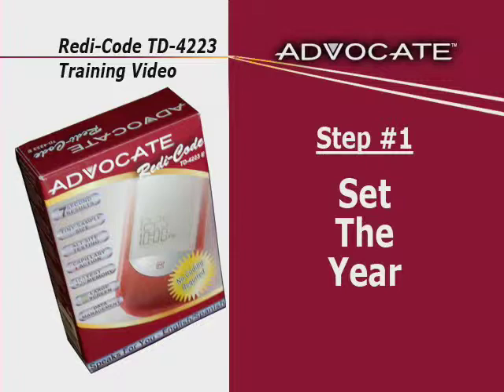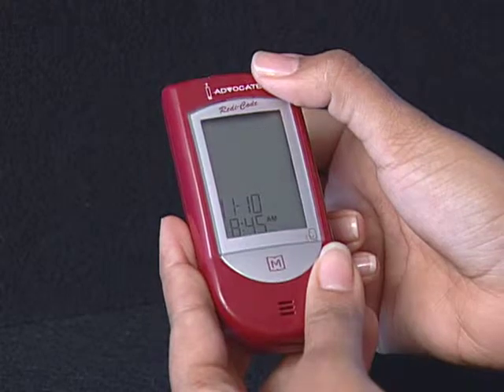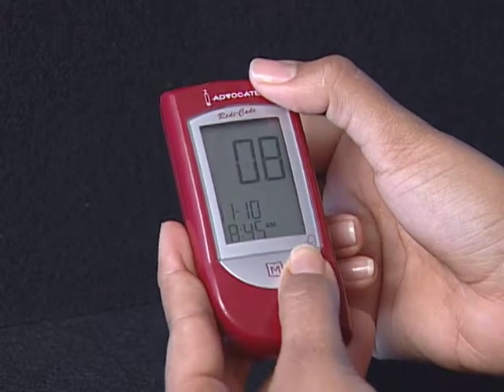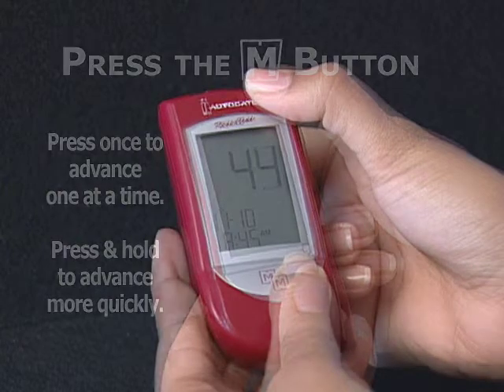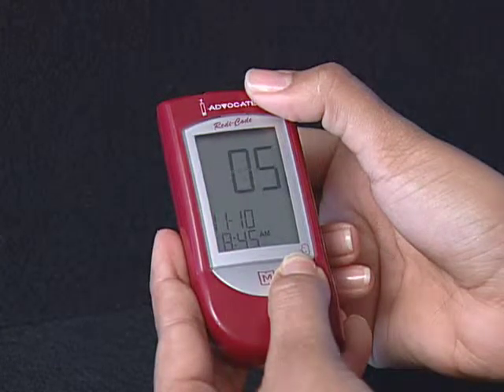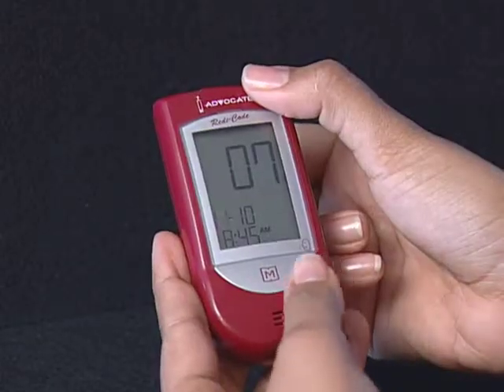Step 1: Set the year. The year will appear first, with the year setting flashing. Press and release the M button to advance one year. To move faster, keep pressing the M button until the desired number appears. With the correct year on display, press the Set button and then the month segment flashes.